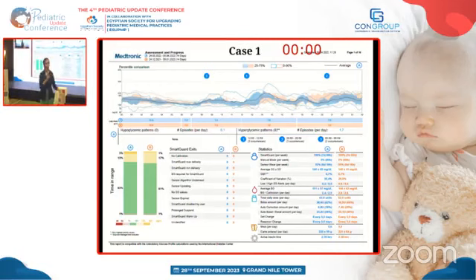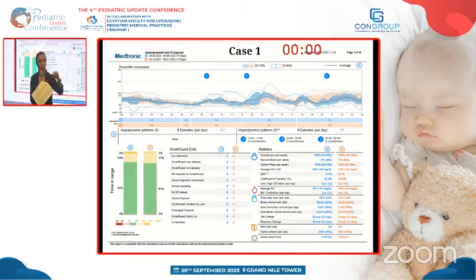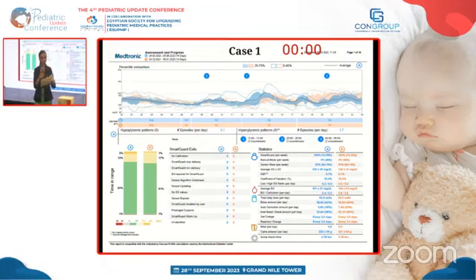طيب ده يا دكتور، السيستم أو الريبورت مش هيكتب لحضرتك البولس الجديد دلوقتي، طبعا هو بس في المانيوال مود. فهو هيقول لك بس التوتال دايلي دوز، وحضرتك اللي هتadjust بناءً على الديلي ريبورت اللي هتبقي شايفاه مع الباشنت. حضرتك اللي هتقرري التعديل، لكن هو فعلا مش هيكتب لك في الأوتوماتيك. انا اديت كام بالظبط دلوقتي، اوكي.